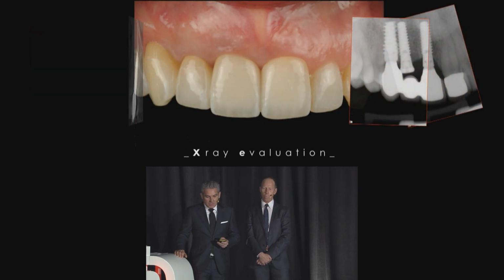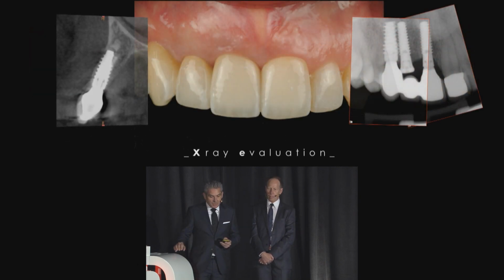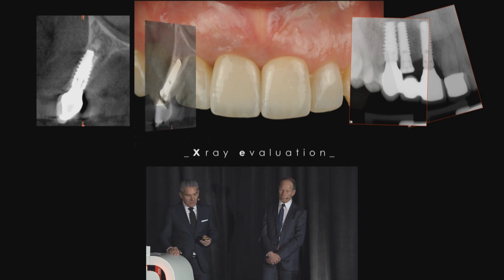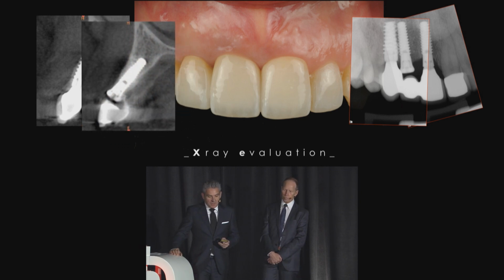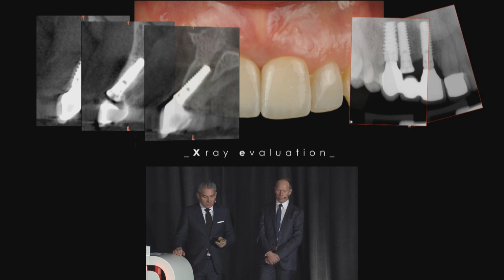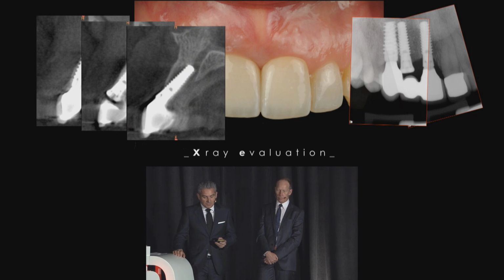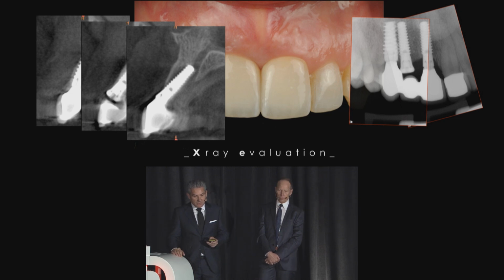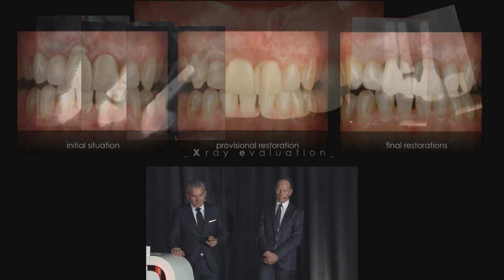So this is the scan of each tooth. You can see the bone, how it's holding the buccal plate. It was a thin one, and you can see some particles of bone going to the apex of the canine. This is the pontic where we have the buried implant, and you can see how small the distance is from where we were. You can see how much we have to compensate. We are almost touching the chimney of the entrance of the abutment.